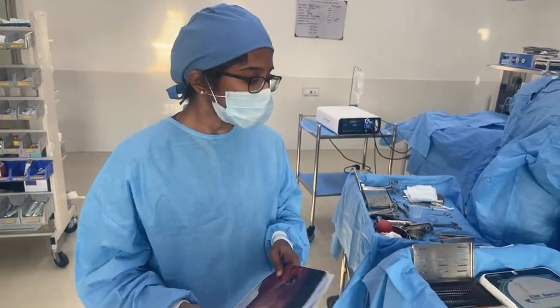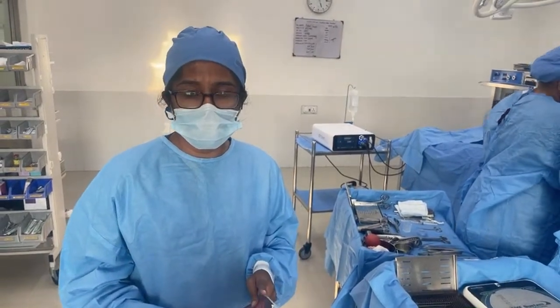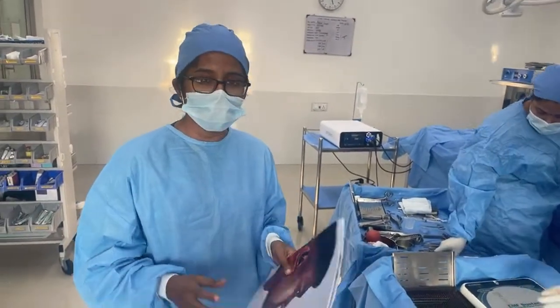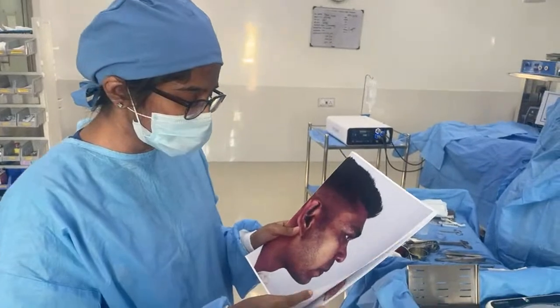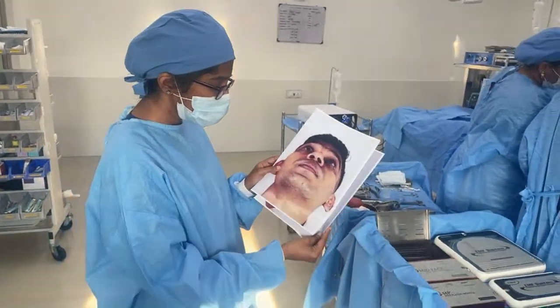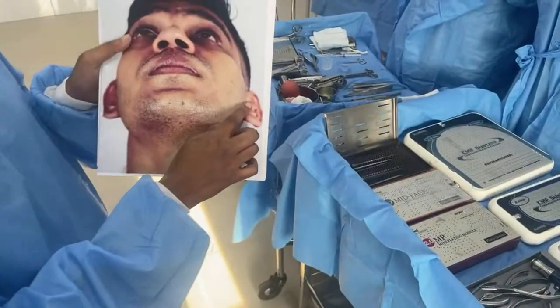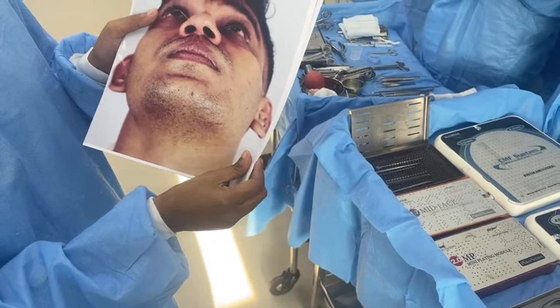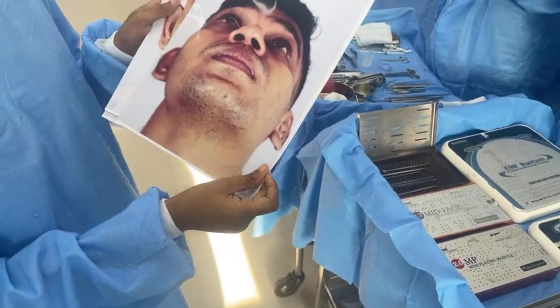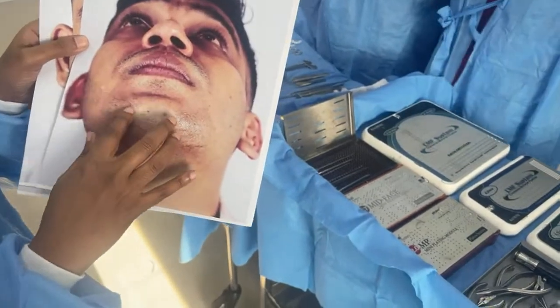Now, the other procedure is what we call an angle osteoplasty, meaning his complaint of the asymmetry over the jaw, which you can see in the frontal view here. See this side. This angle is going to be corrected. We're going to do some work on the bone, which will align with the chin. So he's going to get a nice jawline here.